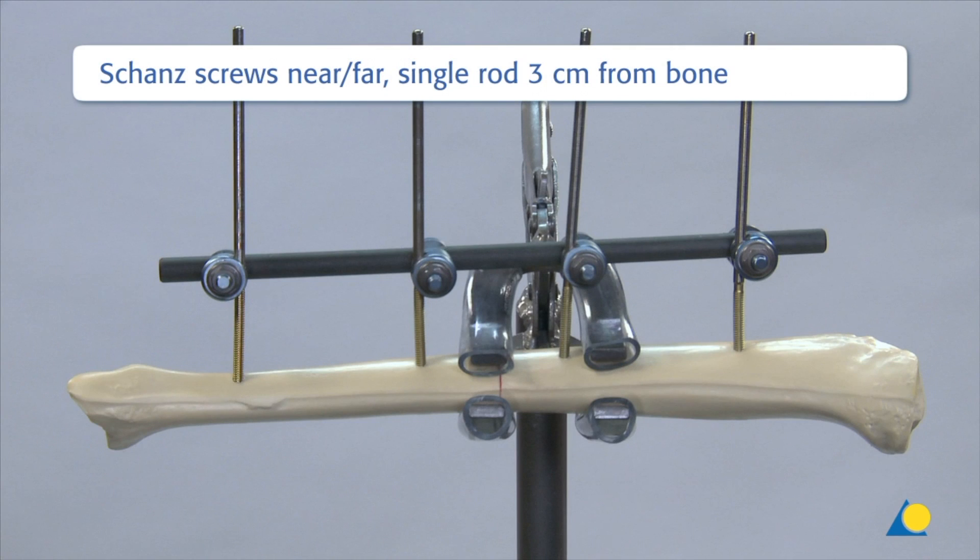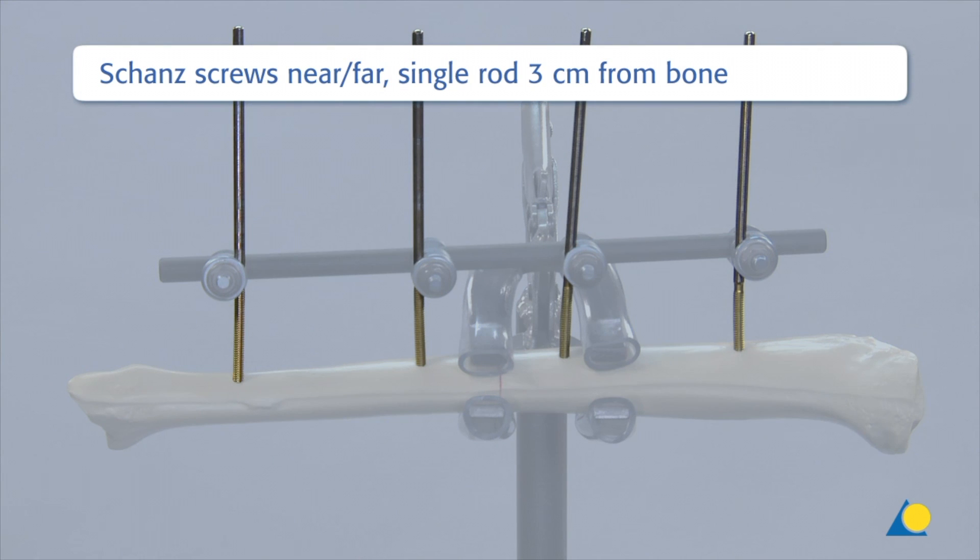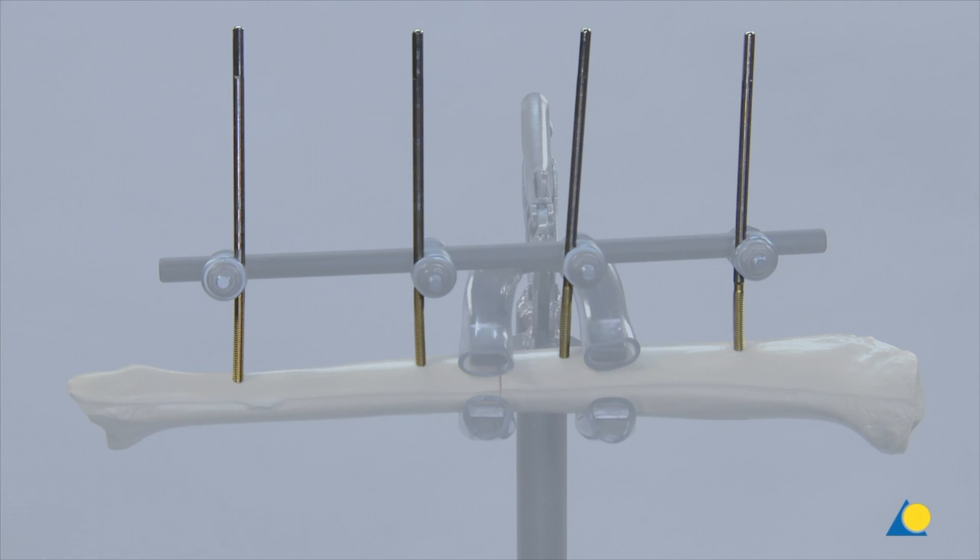In this single rod construction, the Schanz screws are placed in the near-far position. The rod is placed 3 cm from the bone and secured with four large open self-holding clamps.